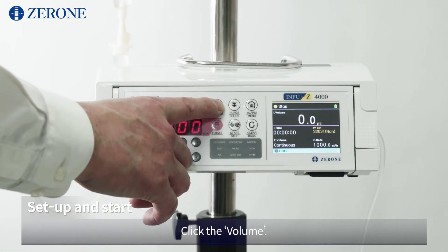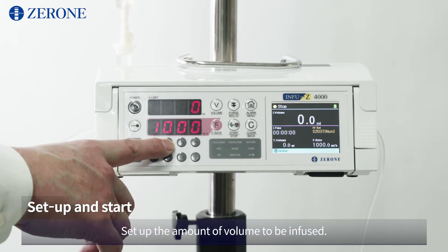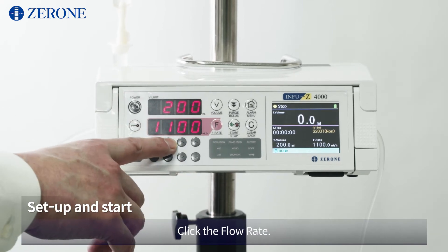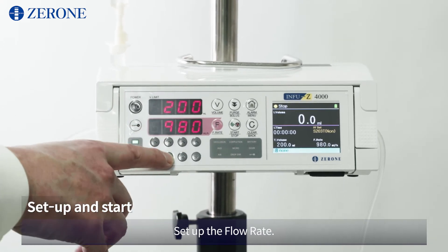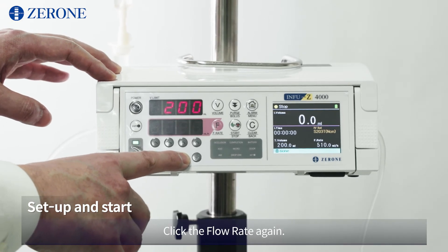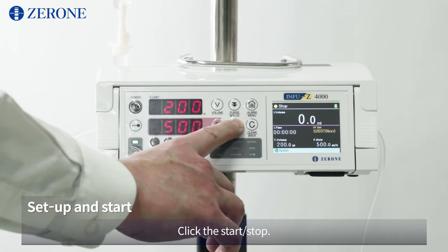Click the volume and set up the amount of volume to be infused. Click the volume again. Click the flow rate and set up the flow rate. Click the flow rate again, then click start/stop.